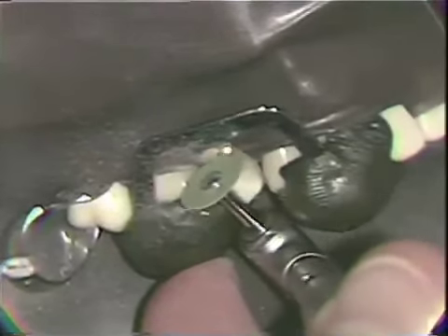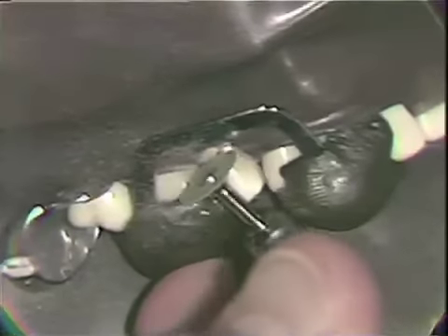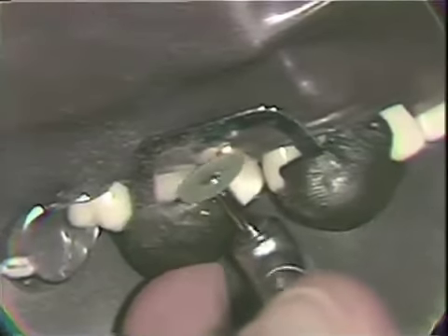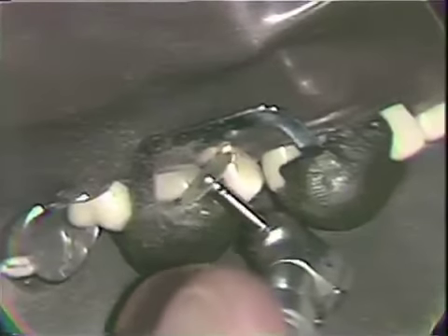Care again coming up just to that margin area and not getting on to cementum and denuding that area. So we'll carry on with the series of paper discs here, bringing about this final contouring, leading in then to the polishing stage.